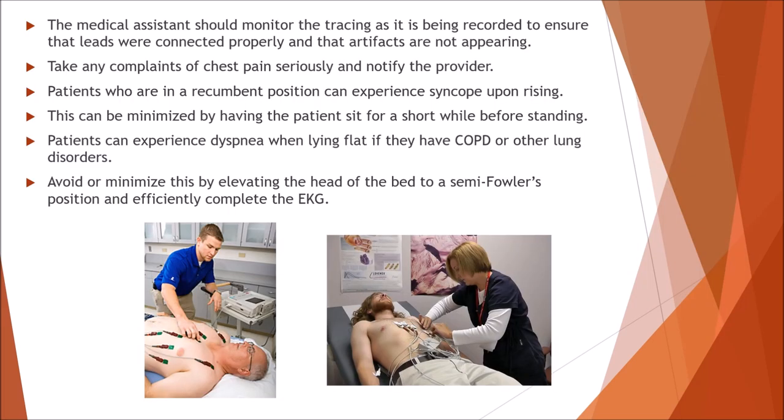Here we see two different images of EKGs being placed by two different people. Both of them are males. Let's talk about a couple complications that could occur. One is artifacts, which I'm going to talk about in a little bit. Another is that you might experience syncope in patients who have been recumbent for a long time. What does that mean? Patients who have been laying down. They stand up too quickly and then could have a syncopal episode. What does syncope mean? It means passing out.